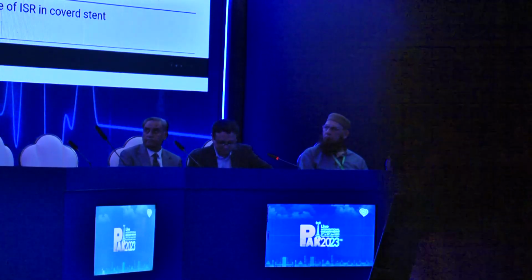Well, if you don't mind, we can ask the panelists online. Maybe Dr. Abbott, if you would like to give any comments. John Abbott? Yes. We need to cover the ostial left main as part of the approach.